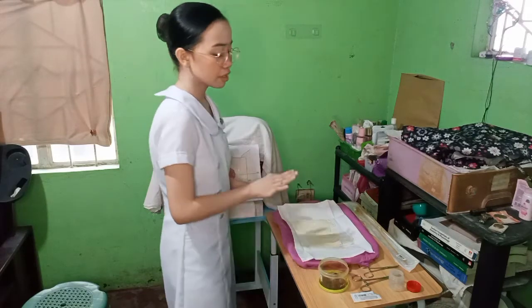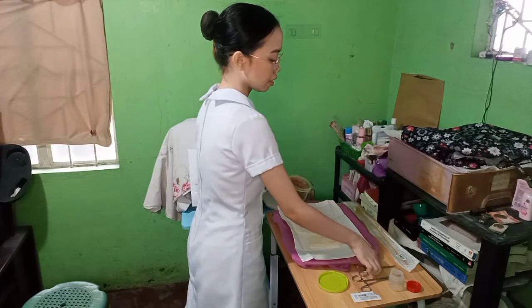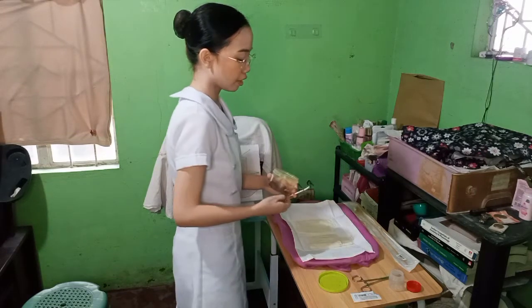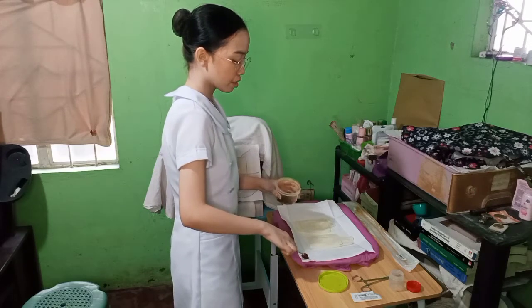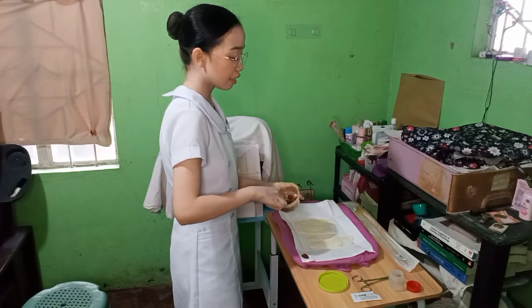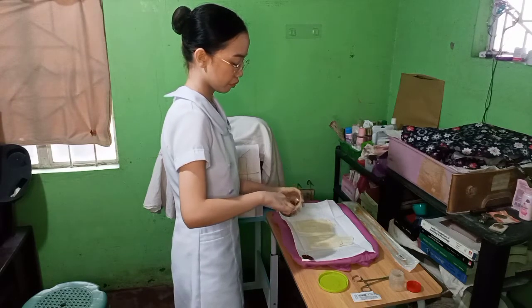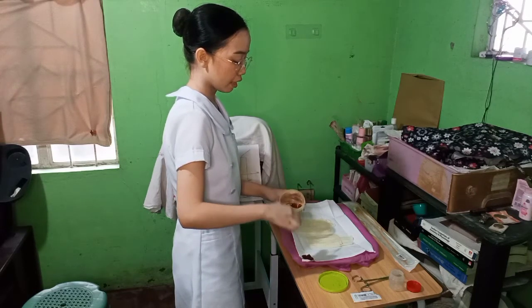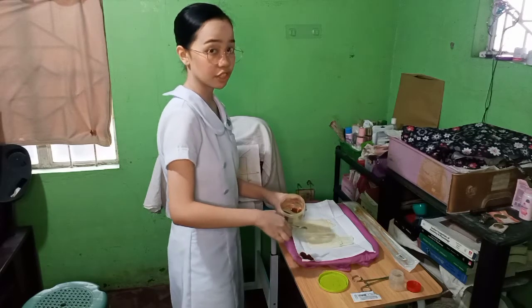And then away from the sterile gloves, place the 8 pieces cotton balls with betadine solution. Betadine is used since this is an antiseptic and disinfectant agent, and it works by killing and preventing the growth of microorganisms in the vagina.